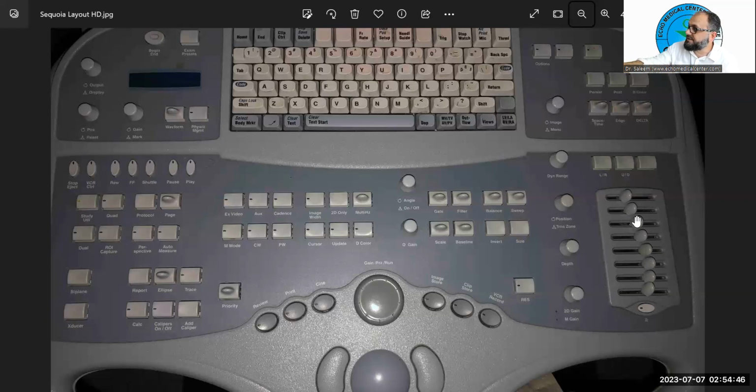They will go by the timing. We know when the sound is fired from the transducer and goes inside the tissue. At the beginning of the picture, we do not have that much attenuation. But when the sound goes inside the tissue, it will slowly attenuate. It will lose its amplitude, power, and intensity. So for that reason, we have to use the time to see where we need to gain.